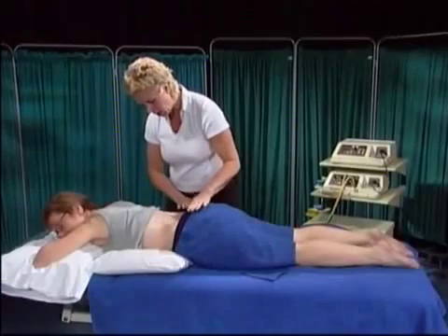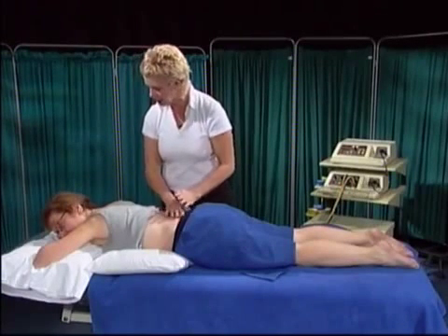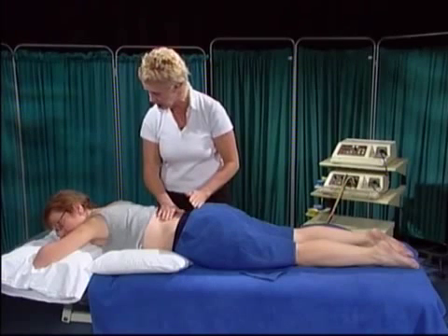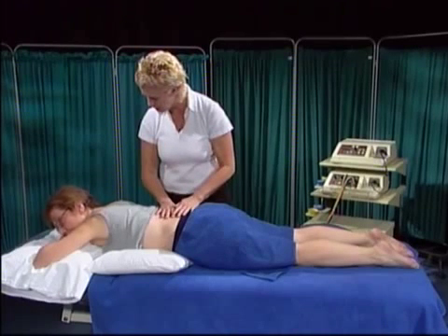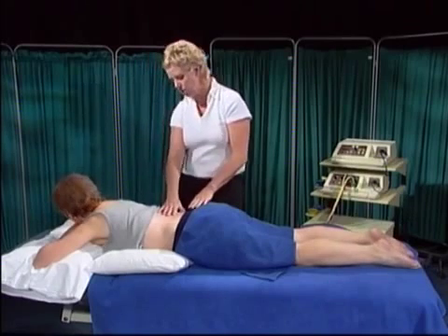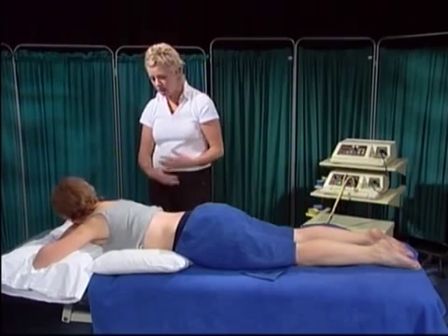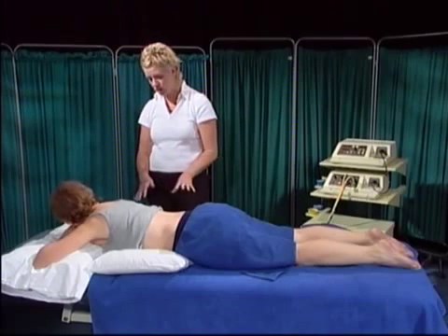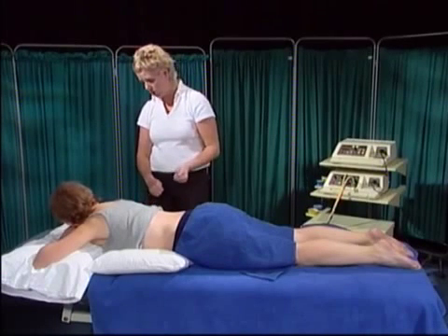Yeah. Okay. Now the interferential, what you will feel is like a tingling sensation around this area of your back where you have your pain. So are you happy for me to do that? Yes. While you have it on, should it make any of your symptoms any worse, or you feel uncomfortable, or in any other situation, you need to let me know and I will come and take it off.